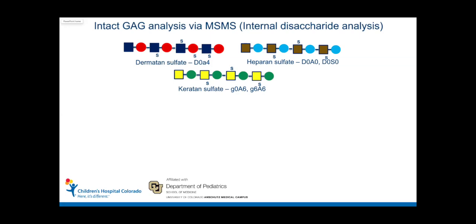So typically what we do is we take a urine sample, we'll treat it with a chemical, or we'll treat it with a series of enzymes to digest these long polymers into those circle and square disaccharides, or two units. We then separate and quantitate using this super cool method called an LCMS. And what we do is we try to measure the amount of these disaccharides using this instrument.